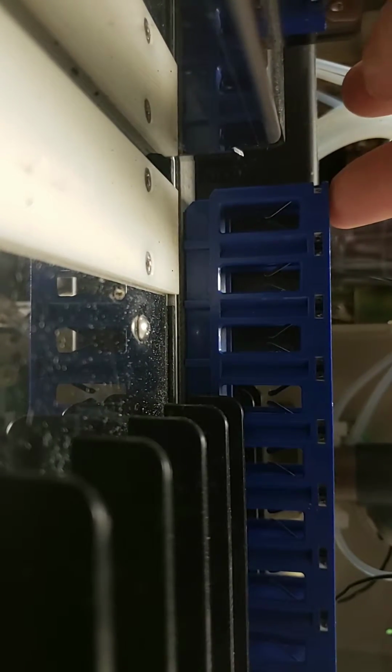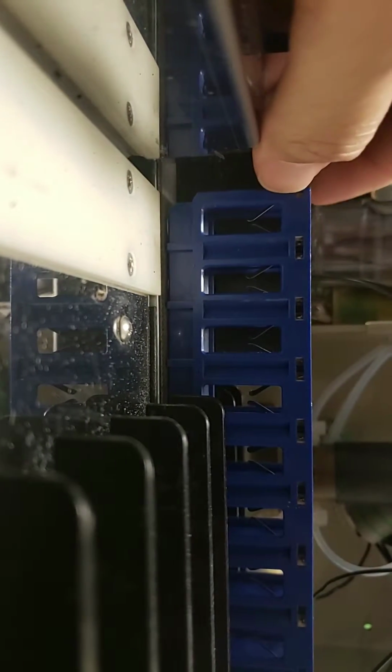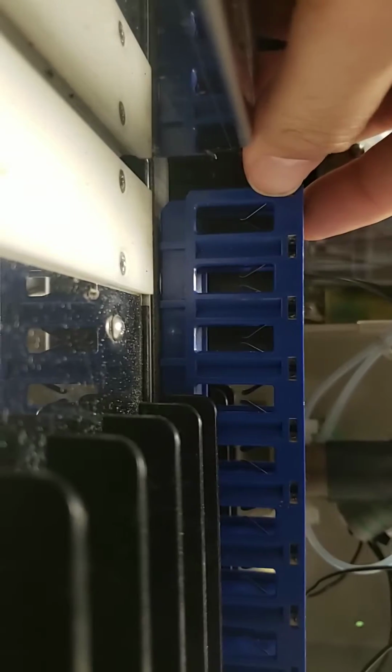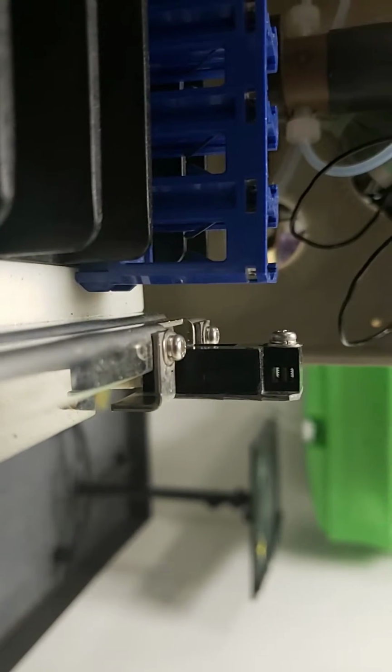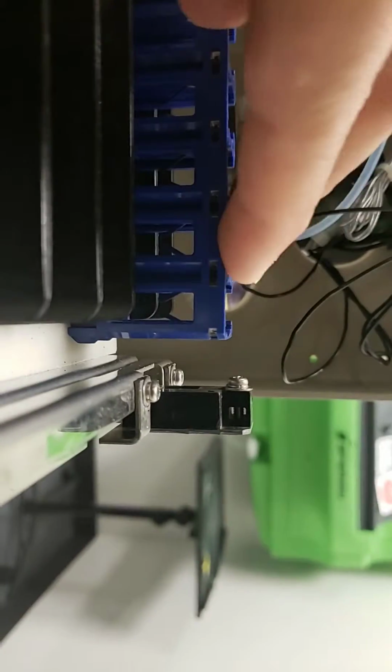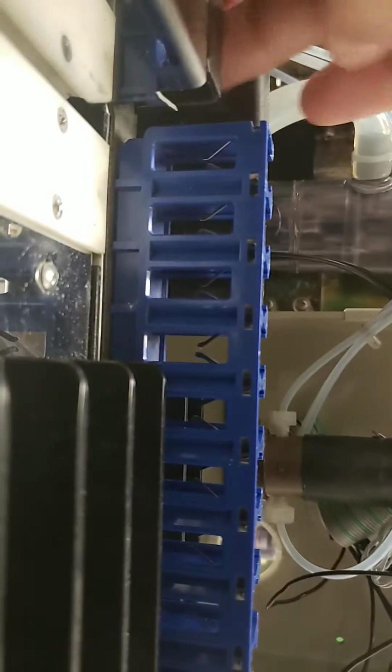We could do a little bit more adjusting, but what happens here is that the belt could basically spin underneath it, especially if the rack is front heavy, and the rack will just basically stay put. It won't move all the way to the end, and that's where you get that error where it'll basically stop short right here because the front end is heavy. You know, and then that back end will just lift off and then the belt will spin. So what you're looking for here is there's a couple alignments.